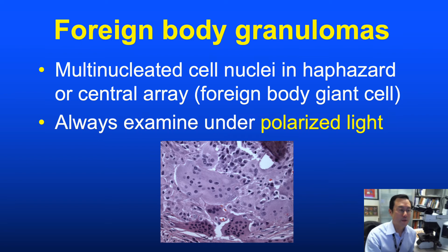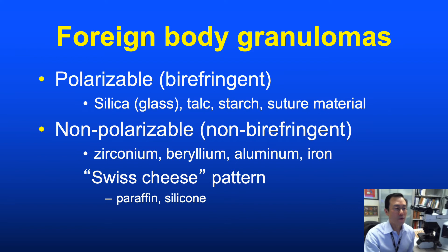In this example of a splinter or toothpick injury, we can see the plant material surrounded by a granulomatous reaction with very prominent multinucleated histiocytes, including large classic foreign body type giant cells. The foreign body granuloma is not one of the four histologic types covered, but the phrase is often used because the causes are obvious. Foreign body granulomas are associated with the 'foreign body type giant cell' — a very large multinucleated cell with nuclei in haphazard array, in distinction from the more organized horseshoe-shaped arrangement of the Langhans giant cell.